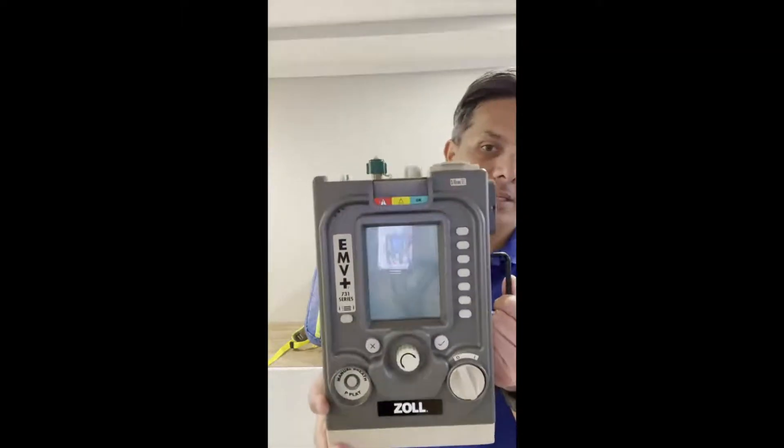Hi, I'm Tito with Zoll Medical, and I'm here to show you the Zoll Z Vent. Before I pull this vent out of the bag, I'd like to talk about its history. The EMV+ vent was designed for the military and commercial market — we sell it across all branches of the military and in other countries. Zoll took that vent, redesigned it, and added new software to make it even better. That same software is in use by the military right now, and we believe it correlates well to what EMS and hospitals need in the U.S. market today.